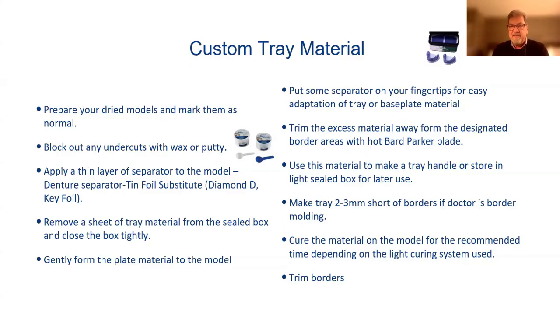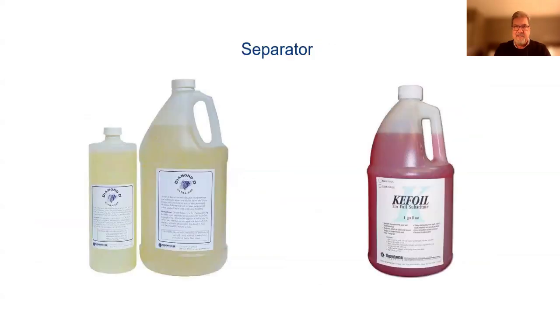After it's cured, I'm going to trim the borders. So real simple. After that, that's your custom tray. It's a great material. This is some of the separator. There's a lot out there. These are some of my favorites. I don't get anything for talking about these. I've been successful with these two separators over the years.